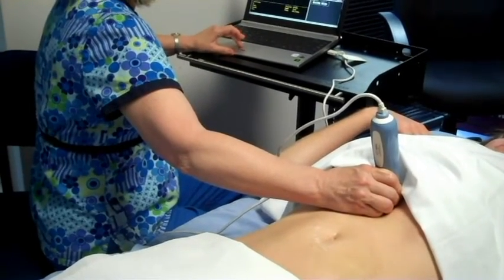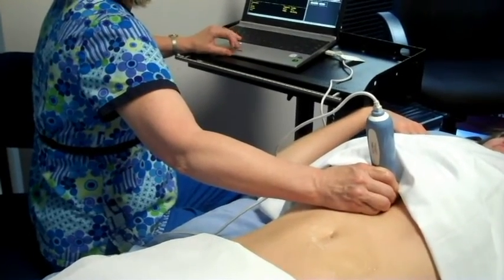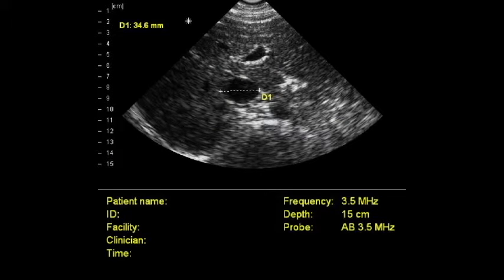Try to acquire at least three views — high, middle, and low. One view should show the maximal aortic diameter.